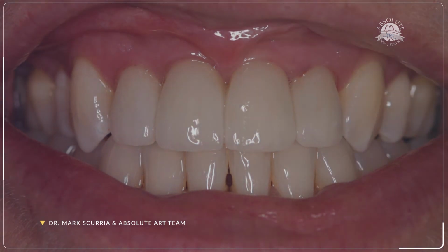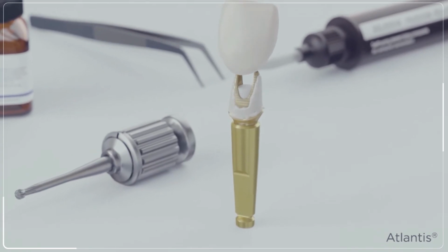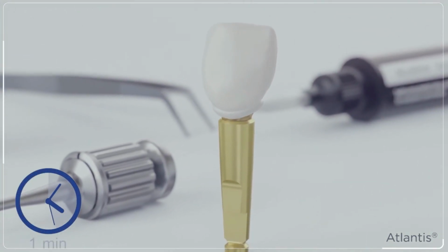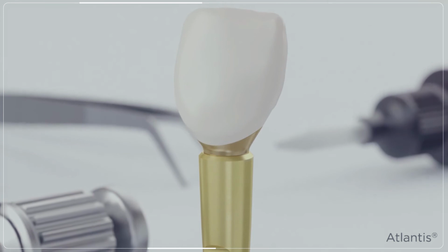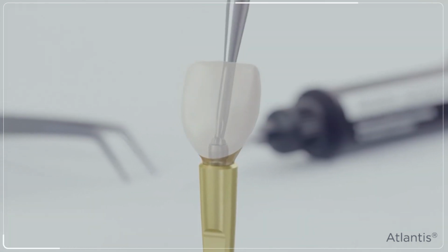So you believe delivering a two-piece is more efficient than delivering one? I think in some cases where we have multiple units or interproximal contacts are closing in, it's easier to deliver the case as an abutment with a positioning jig, process all your adjustments intraorally, cement, remove, clean up, and replace.